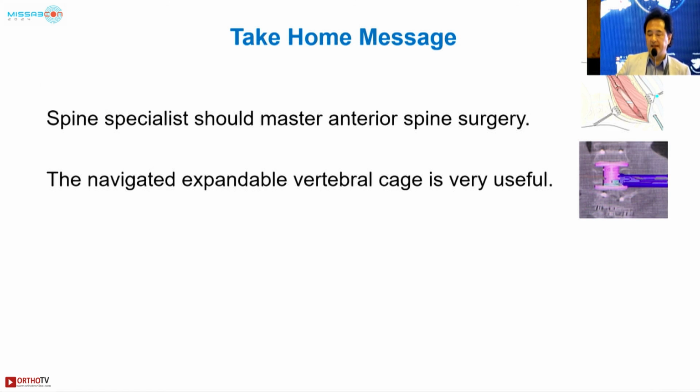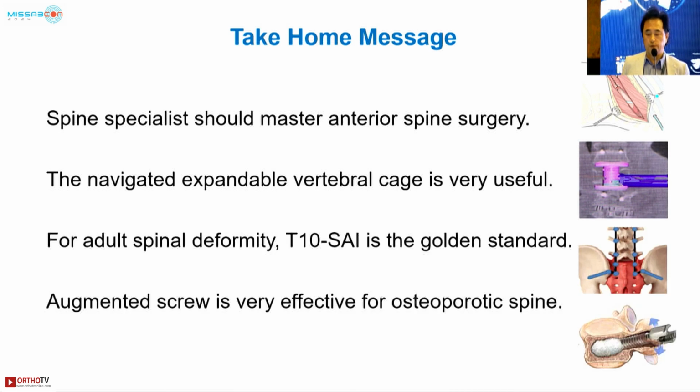So the take home message of my talk: spine specialists should master anterior spine surgery. Navigated expandable cage is very useful. For adult spinal deformity, T10 to SAI is the gold standard. Augmented screw is very effective for the osteoporotic spine.